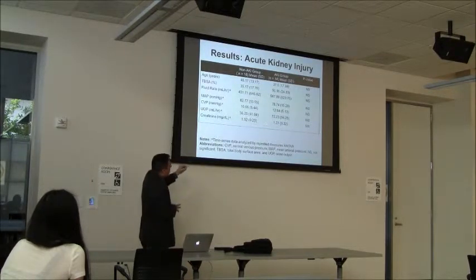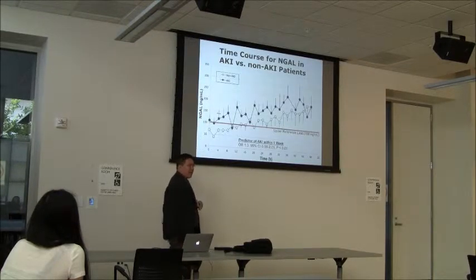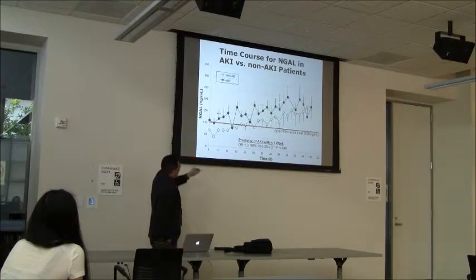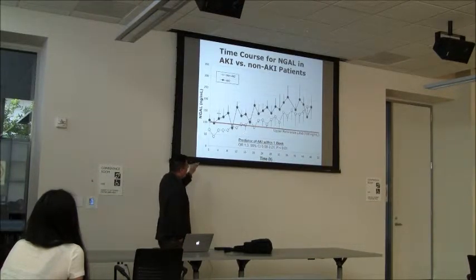The creatinine was not significantly different from each other. That's our biomarker for renal function. It didn't tell me that these patients had acute kidney injury. That's not good. Let's look at NGAL, that biomarker. The black line are the patients that had AKI, x-axis time, y-axis is the biomarker levels. You can quickly see that the NGAL levels shot right up in those patients that were not getting enough fluids, that were going to get AKI over the course of 1 week. And this did serve as an independent predictor of the disease.